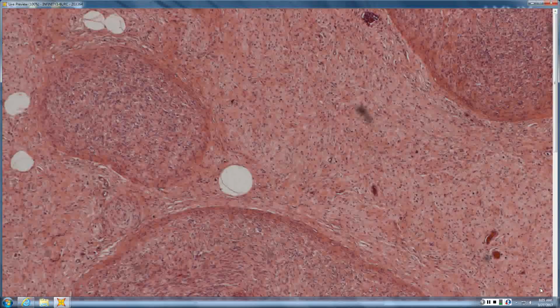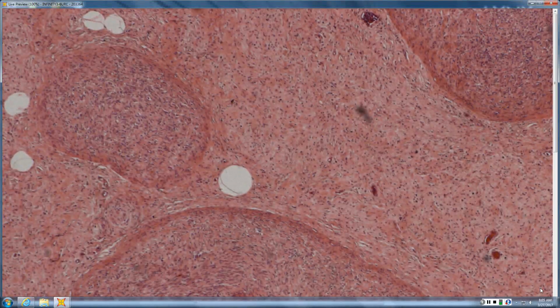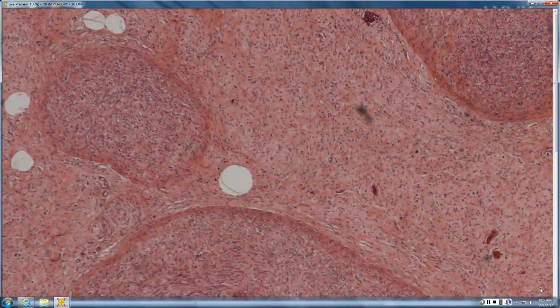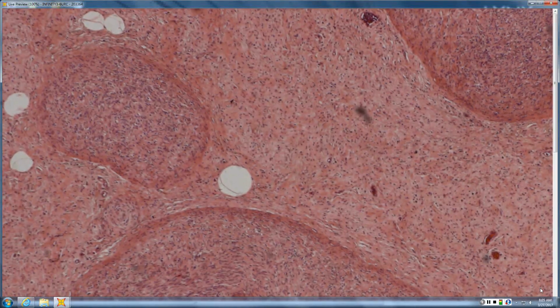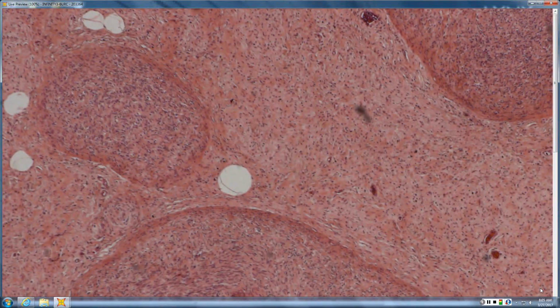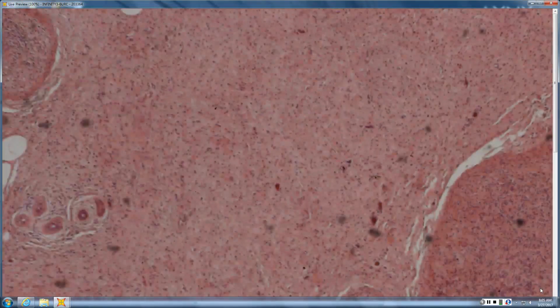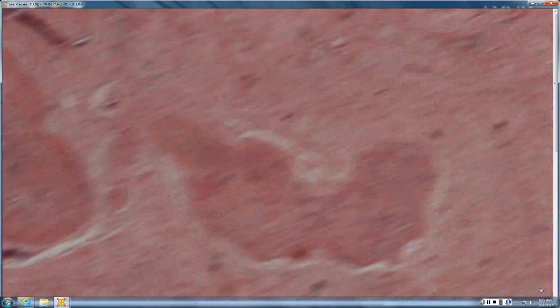I thought that the Triton tumor was supposed to have rhabdomyoblasts and not fully mature striated muscle. You can. I've seen, well, let's read about it. It's a rare tumor. I've never diagnosed one. I've only had them sent to me in consult. And they've had immature muscle and they've had ones with mature muscle. But let's read and see what the books say. Okay.